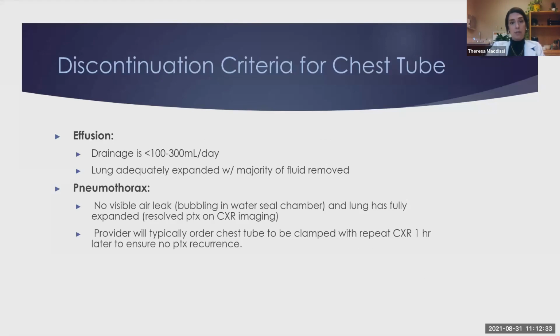In these times when you are clamping this patient's chest tube, you want to make sure that you're monitoring them pretty closely. You want to make sure that they're not having any signs of hemodynamic instability, becoming more hypoxic, cyanotic, having more pain, all those things. You would want to immediately unclamp the chest tube and call the provider, because perhaps there's been development of a pneumothorax while that chest tube is clamped. So you want to monitor your patients really carefully after you've had them clamped.